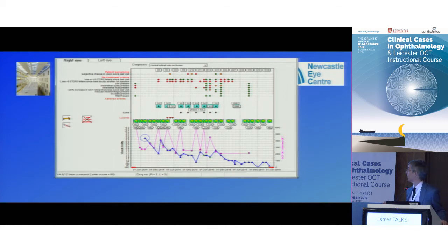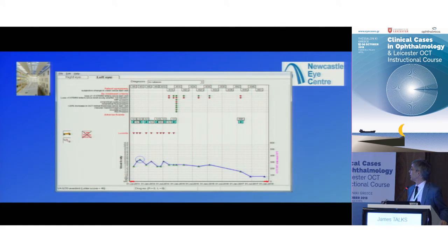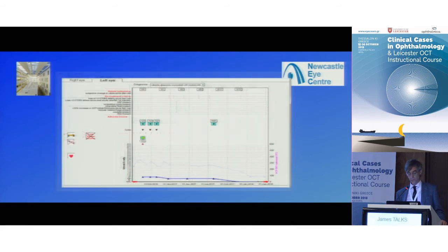We've delayed what happened in this patient, and when we left them and followed up, it came back. And we've got another one, similar scenario, where we did a load of injections. The vision never really got very good, so we stopped. And then it wasn't until another year or so, in fact, that the rubeosis developed. So it does certainly delay it. Another one where we tried, and not everybody, don't get me wrong, not everybody you inject will do well. So these people had 3 injections and they never recovered. So maybe better just to laser them rather than carry on.